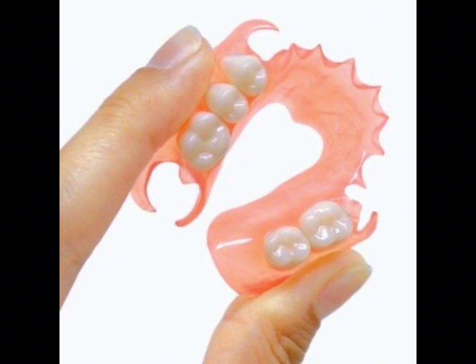Remove your dentures at night to allow your gums to rest and recover. Some people, when they want to go to bed, wear the dentures, especially those wearing removable dentures. They don't remove them at night, and it is not good. When you want to go to bed at night, remove your dentures.